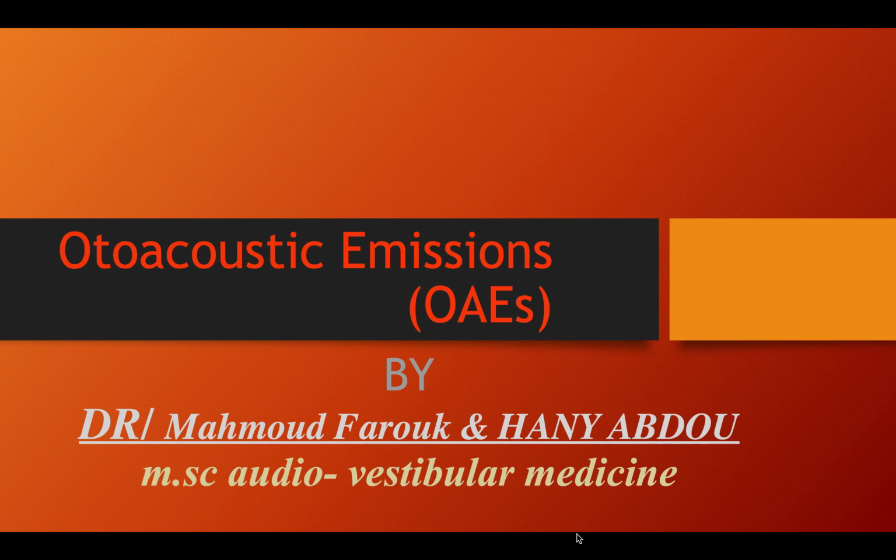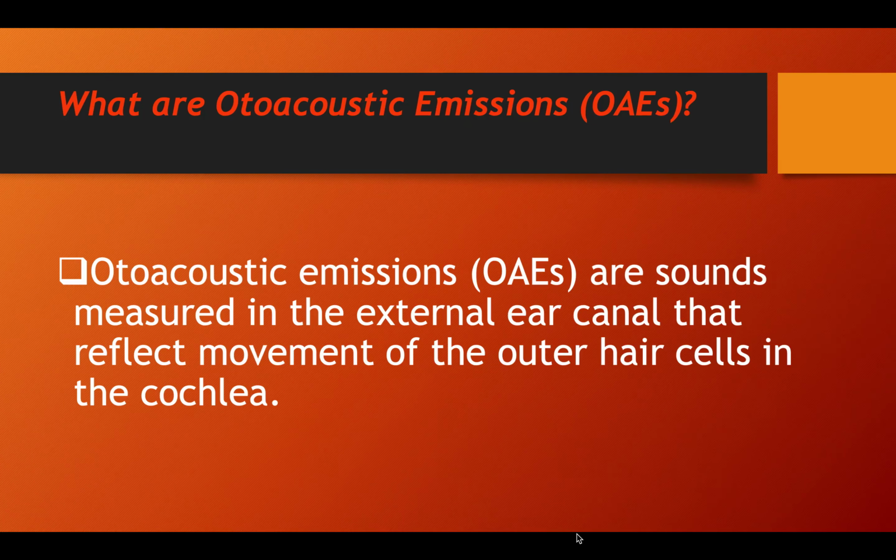Hello everyone, my tutorial today is about acoustic emissions. Let's move on. First of all, what are otoacoustic emissions? Otoacoustic emissions are sounds measured in the external ear canal that reflect movement of the outer hair cells in the cochlea.